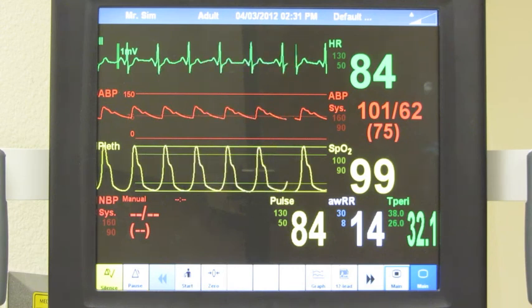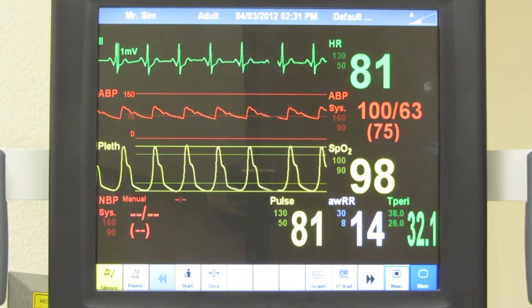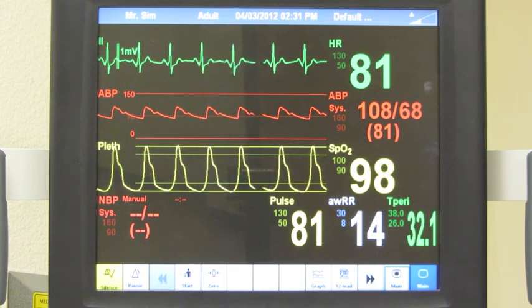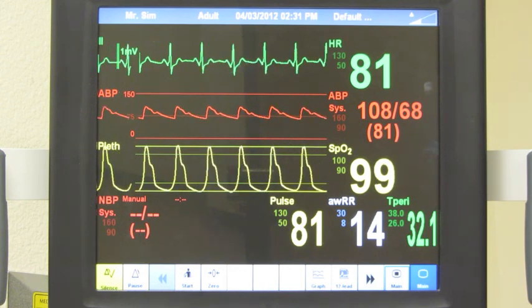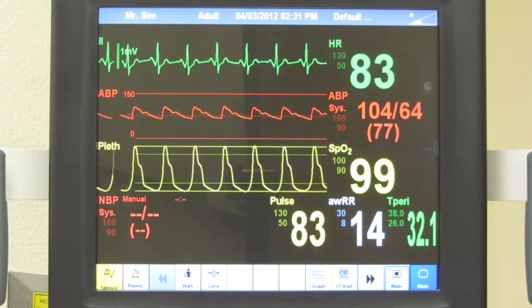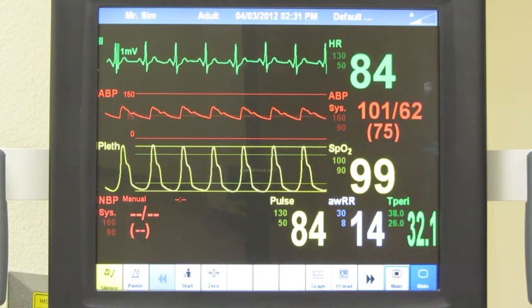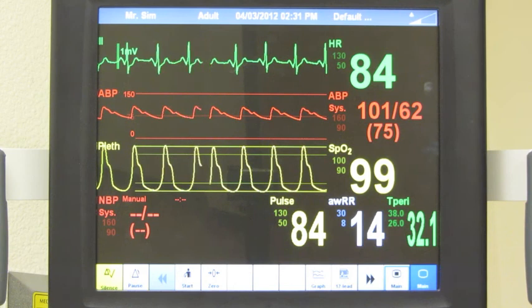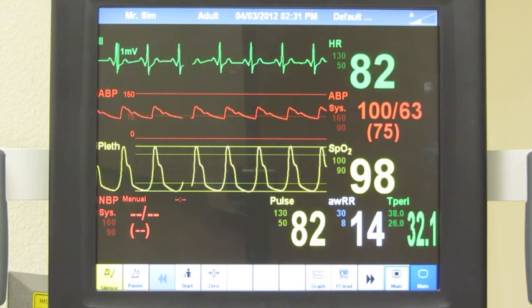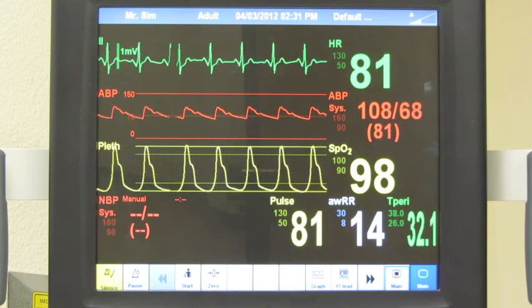All of this information is based on the following assumptions. The ST segment was isoelectric at rest and became depressed during the activity. Assumption number 2: there was an absence of cardiac medication that would alter the response to testing, such as digoxin. The third assumption is the absence of metabolic abnormalities during the testing, such as hypokalemia. If these 3 assumptions are correct, and you see a horizontal or downward sloping ST segment as a new finding, that should be a cause to discontinue the activity.